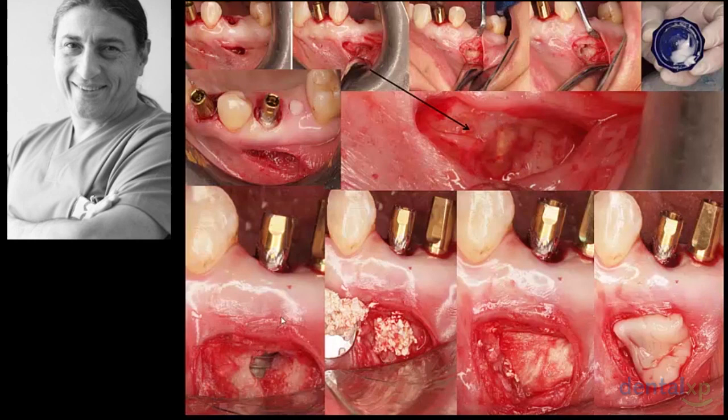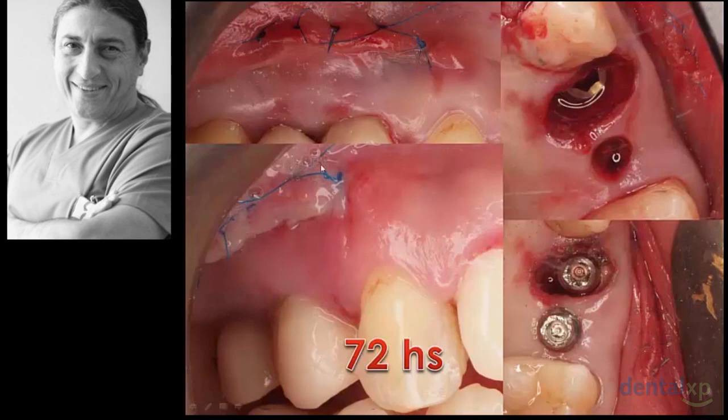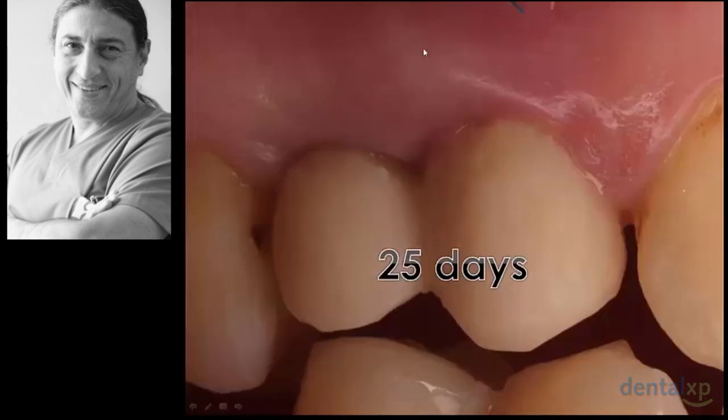So we extracted, then we inserted the implant, but in this part there is the socket shield, and we did some regeneration, membrane and PRF, and also we did immediate loading because we had a good insertion torque. And here we have the socket, and this is in that place, in the ridge, the tooth was extracted many years ago. And this is the healing after 25 days.